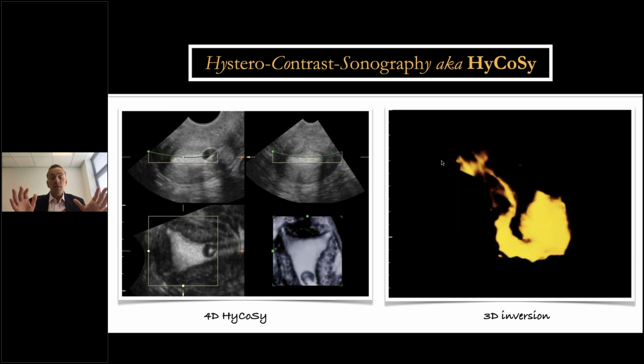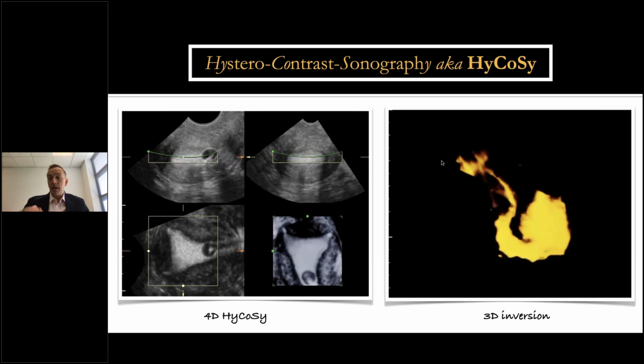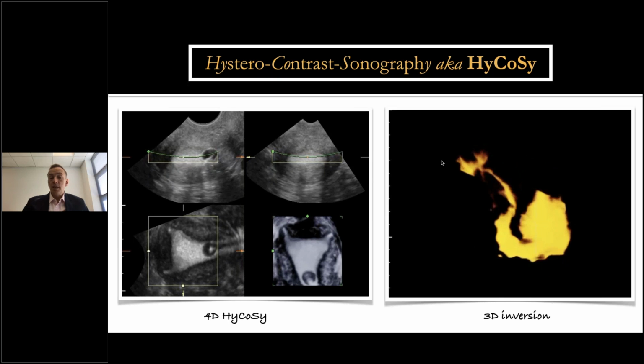So I think even though the procedure itself is straightforward, the scanning level that you need to be able to confidently follow the dye so that you can confidently say the tube is patent or not, it is quite tricky actually in some cases.